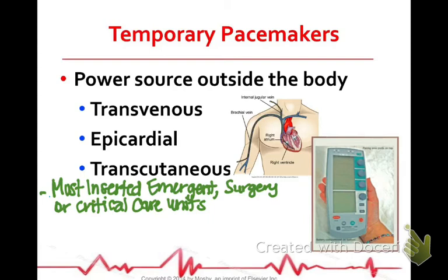And most of these are inserted emergent or used emergent, the transvenous. Epicardial, a lot of times surgery or critical care units. You see the external power source.